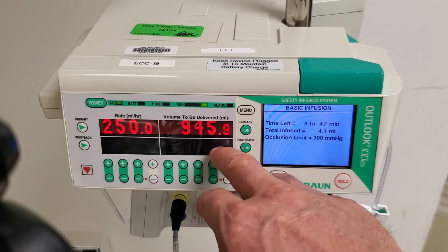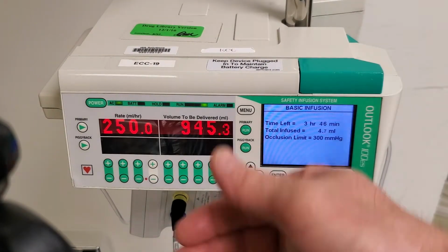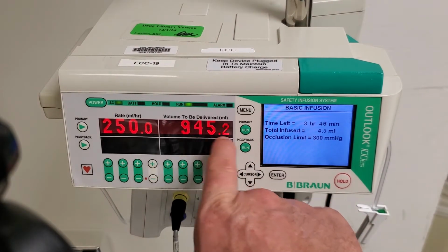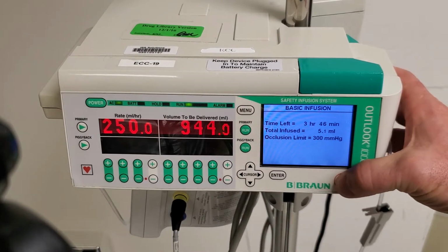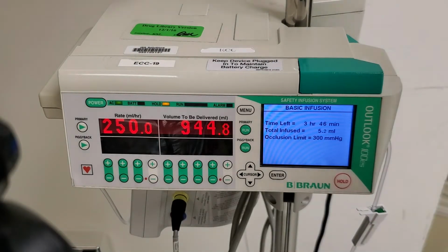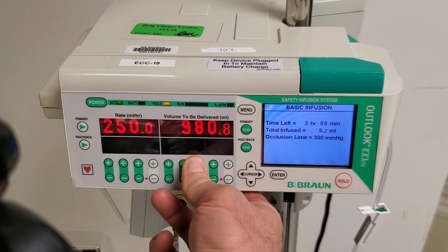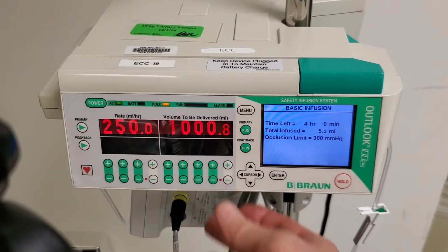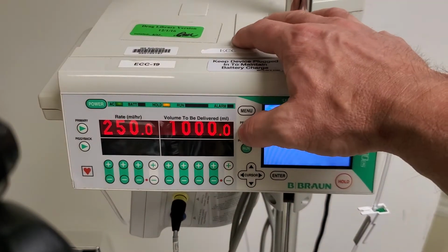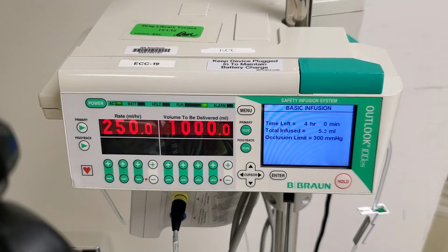The only other thing to know is if you're on a long transport and you need to change bags, you're delivering 2 or 3 liters of fluid. As your volume to be delivered gets down to 0, you would hold the pump. Now the pump is not running. You would change your bag, and then you can reset your volume to be delivered to whatever your number that you want to use is. Always hit run after you've made a change, and now your pump is running again.